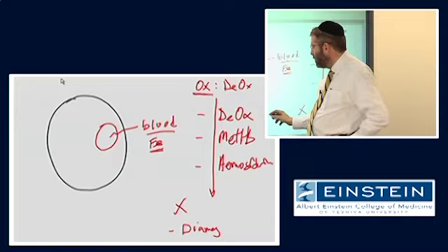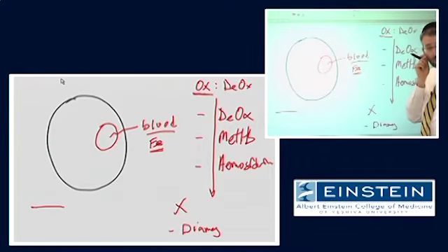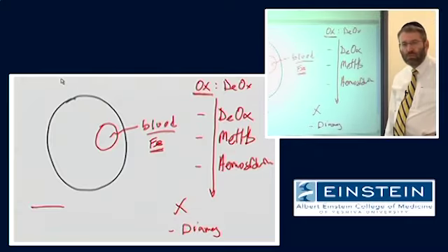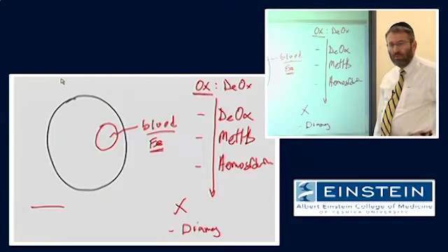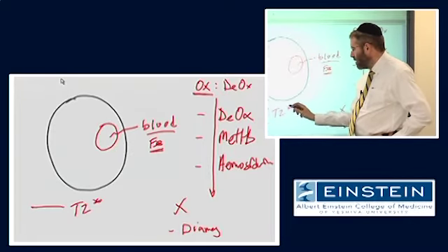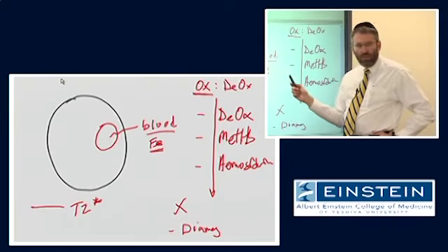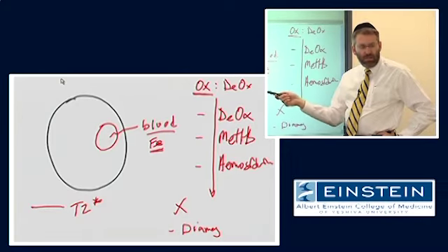Now, by the way, if you wanted to maximize your ability to detect this effect, what type of image would you use? Right. You would want to image T2 star. The spin echo is going to compensate for these magnetic susceptibility effects.